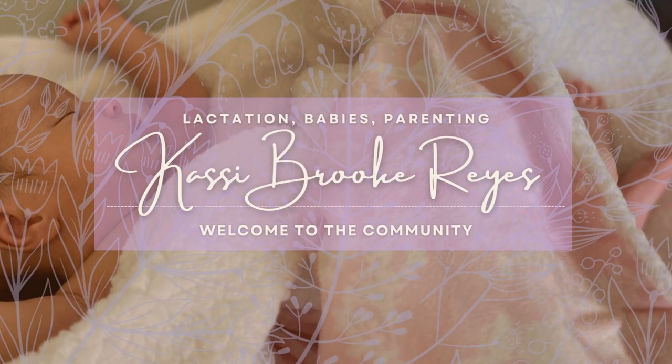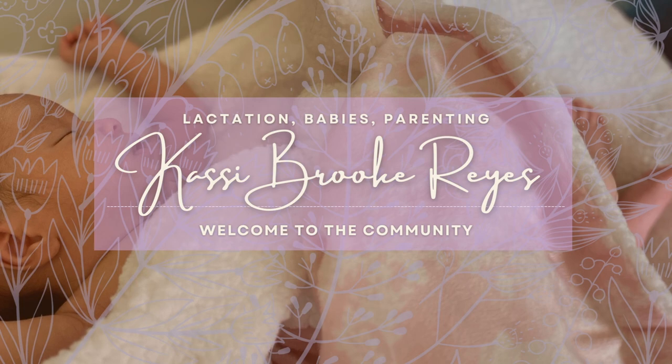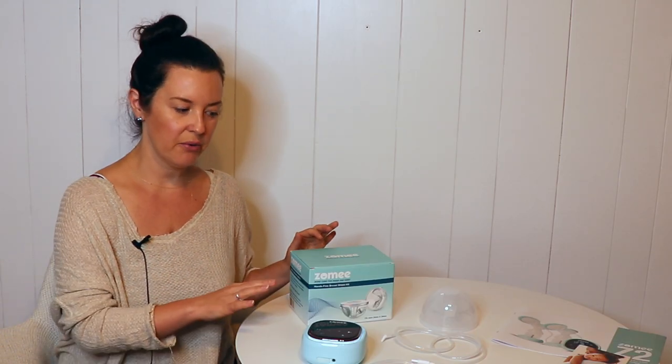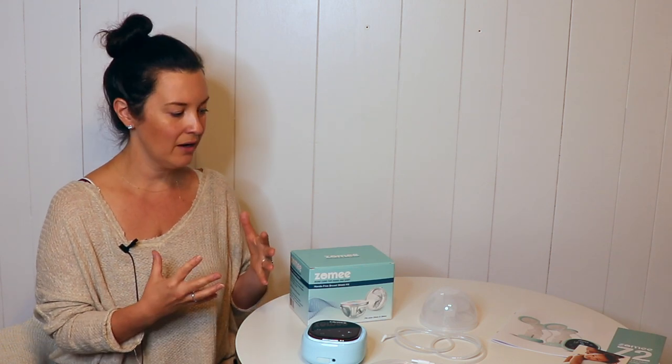Hi everyone! As I promised on my previous video about the Zomee pump, in this video I'm going to take a closer look at their hands-free collection cups. This is a new add-on from Zomee to go with their portable pump, with the idea of making the cups a little bit more discreet if you're using the pump to pump in public or at work. So let's take a look at the cups.